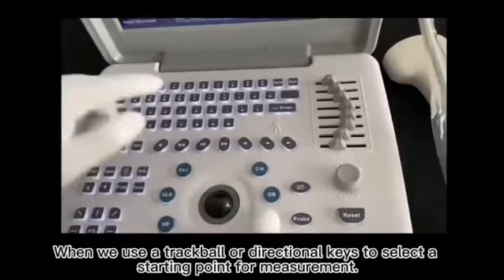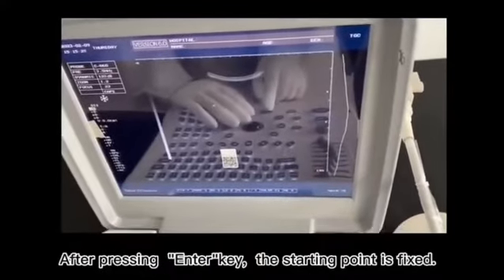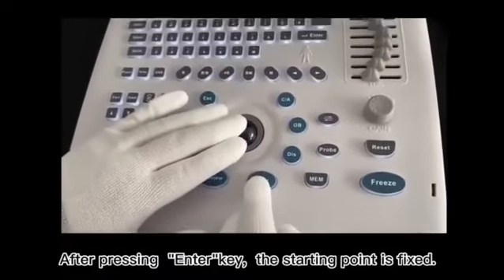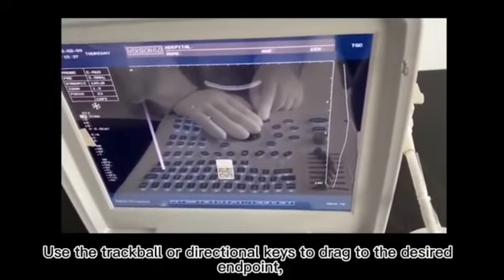We use the trackball or directional keys to select a starting point for measurement. After pressing the Enter key, the starting point is fixed. Use the trackball or directional keys to drag to the desired endpoint.